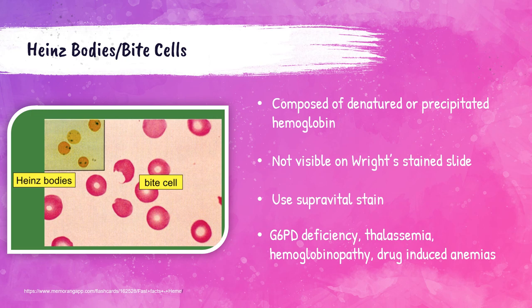This photo shows bite cells, which you would see on a Wright stain, and Heinz bodies, which you see on a supravital stain like new methylene blue. Heinz bodies are multiple inclusions caused by denatured hemoglobin, and these inclusions are invisible in a Wright stain, causing these bite cells — it looks like the cookie monster has taken a bite out of the red blood cell. If the blood sample is stained with new methylene blue, you would be able to see the actual inclusions of the denatured hemoglobin. These cells can occur in patients with G6PD deficiency, thalassemias, hemoglobinopathies, and drug-induced anemias.